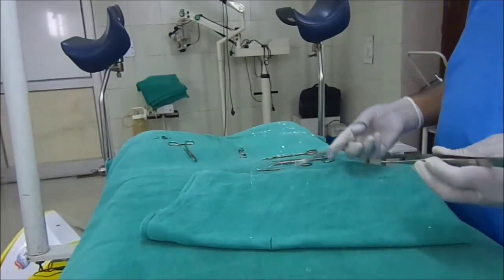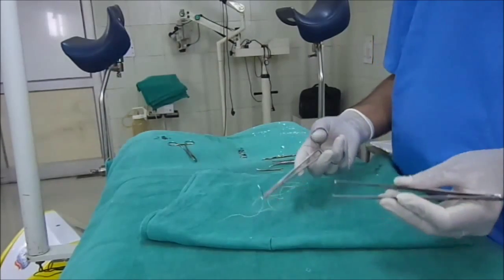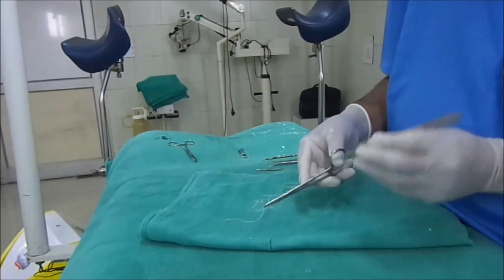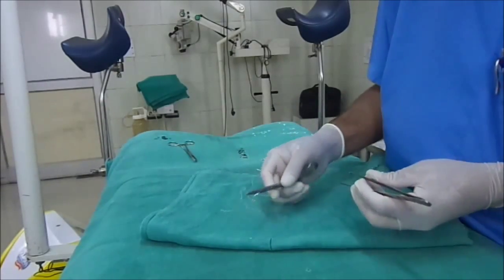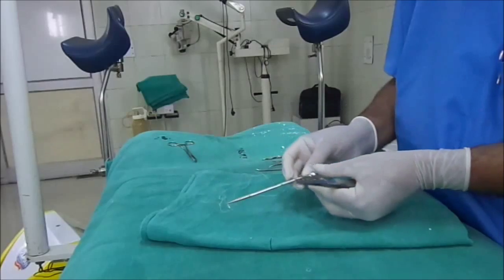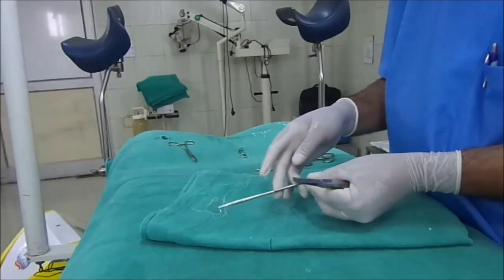Now, what care should be taken while making the suture. There are many types of suturing. I am first demonstrating the simple interrupted suture. I will show how to hold the needle holder.